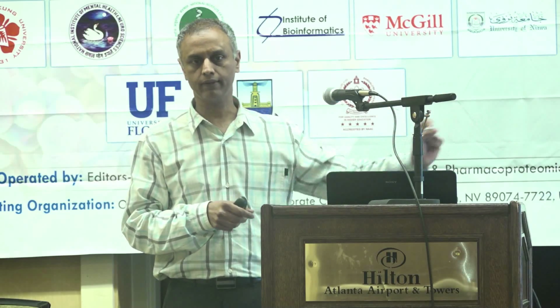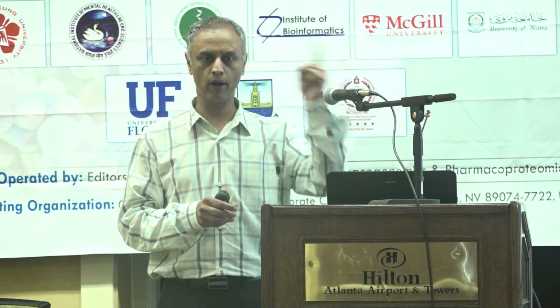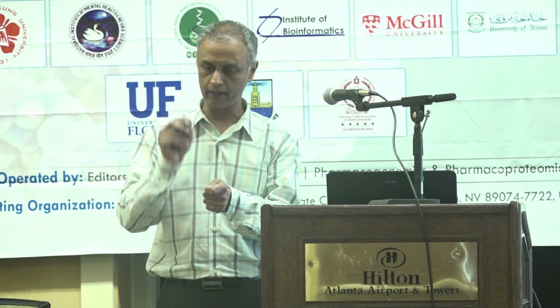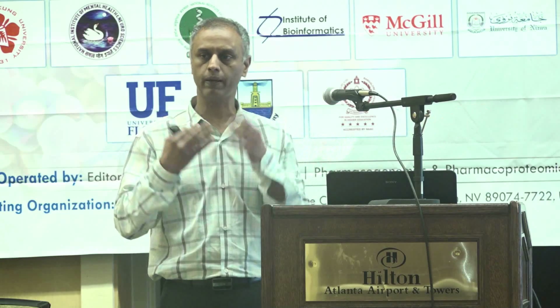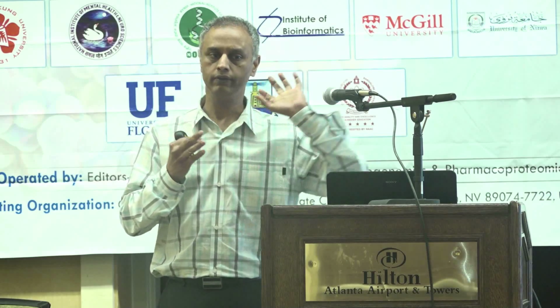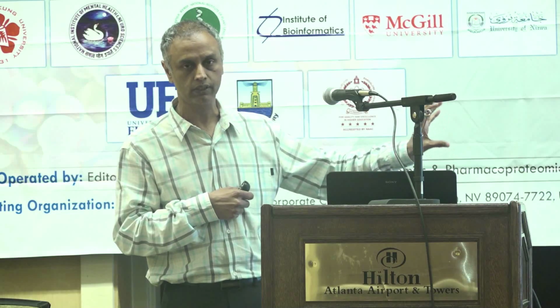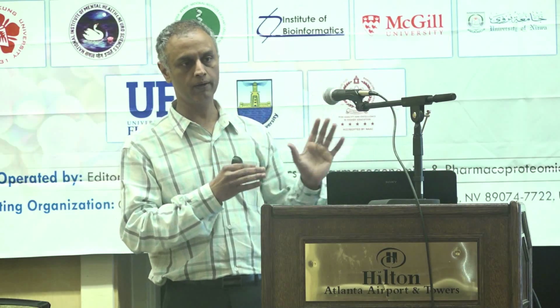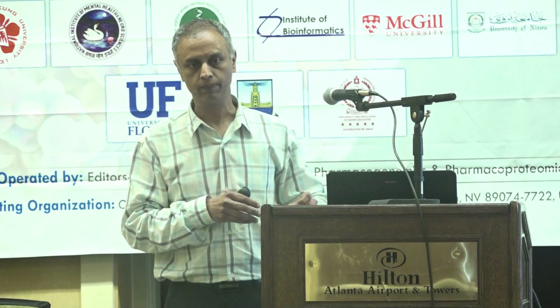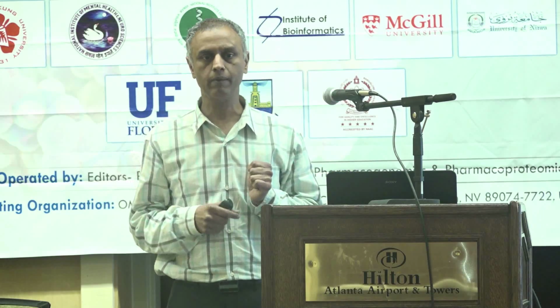The proteomics assays that I talked about, they take 10 minutes per sample. So that means in 1 day you have the material, the microbiologist is starting to think what it is, and in 10 minutes we subject it to this kind of mass spec. We have the answer of what it is and what resistance it encodes for this very important class of last resort agents, carbapenems. So 1 day and 10 minutes, we have the answer. If we did next-gen sequencing, we'll have it in 2 days. Well, in that setting, 1 extra day may be too much.